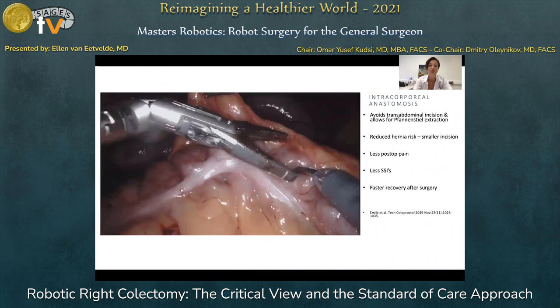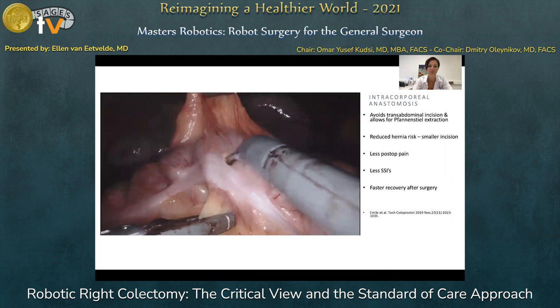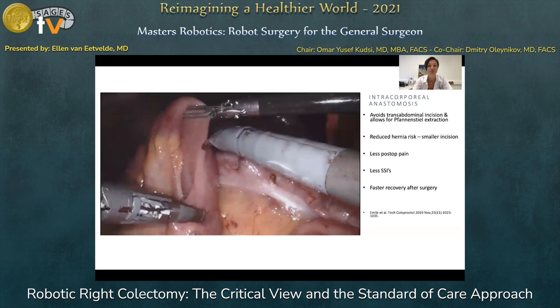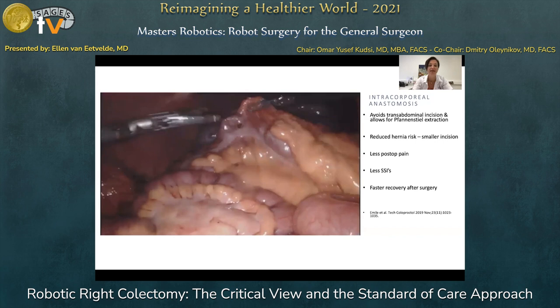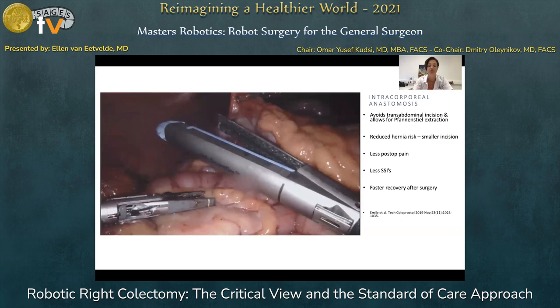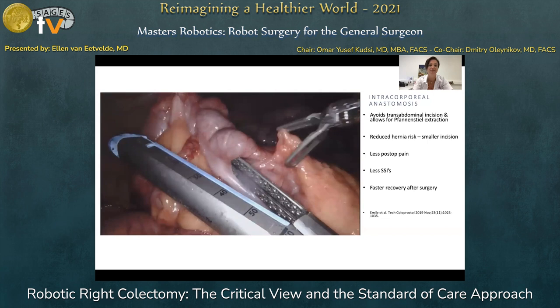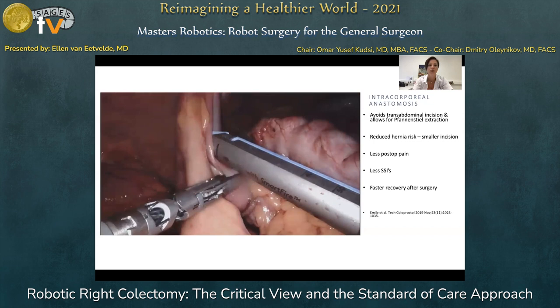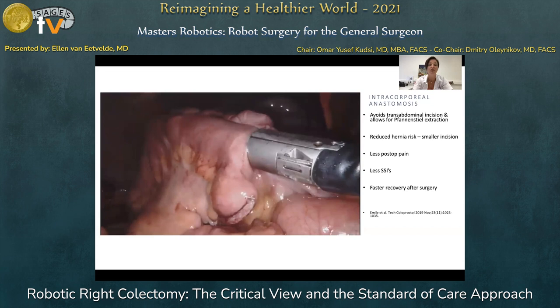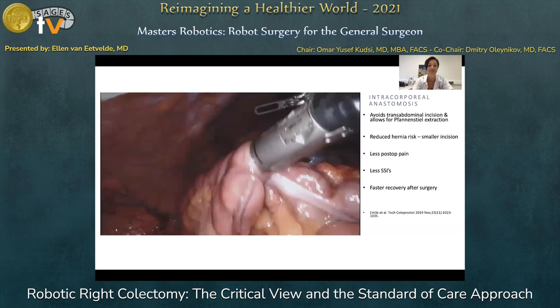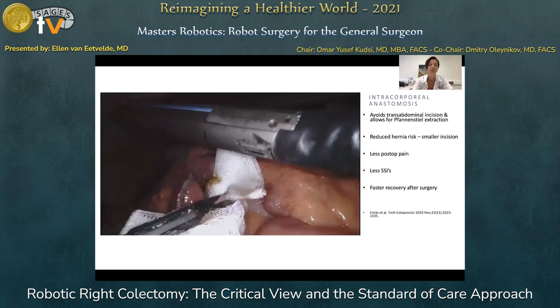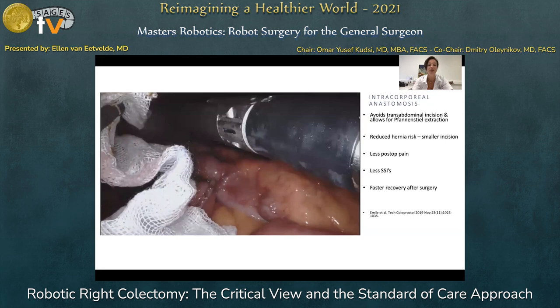The first thing we change in our habitual technique is to switch to intracorporeal anastomosis. After transection of both bowel segments, we perform an enterotomy on the transverse colon and on the terminal ileum at the anti-mesenteric side. We then introduce the stapler in port number three, open the jaws, and lift up the tips towards the anterior side of the abdomen. We can then use both hands to gently slide both bowel segments over the opened jaws, close them, verify before stapling, and then staple. We like to place a swab underneath the stapler to prevent leakage of stool and to clean the stapler before removal.